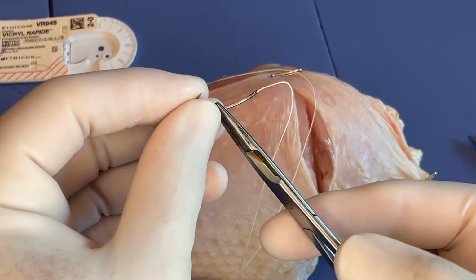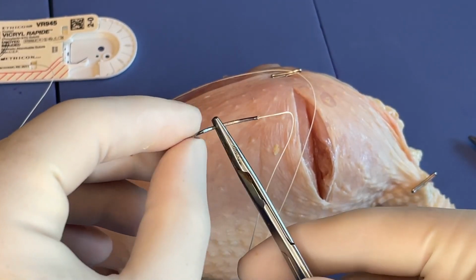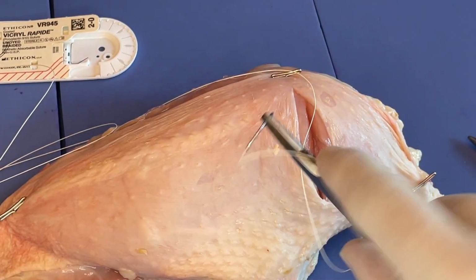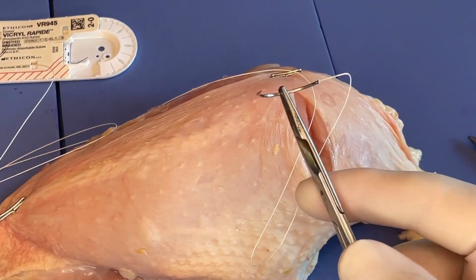So if you're working with an area where you've got thinner tissue, so you don't need quite as much penetration with the needle, then you can kind of choke up on it here, and you don't have to crank so far over to be able to get that needle to go perpendicular into the tissue.